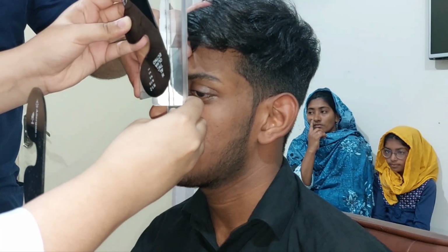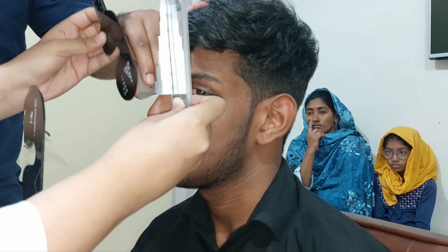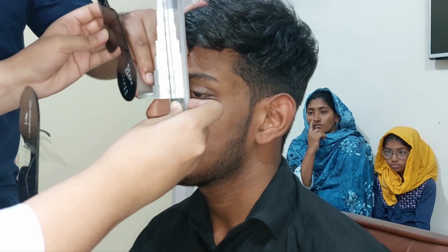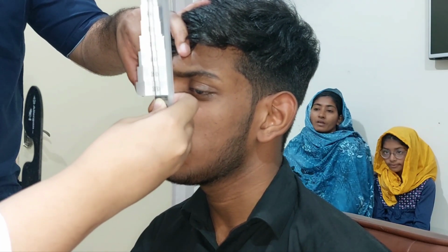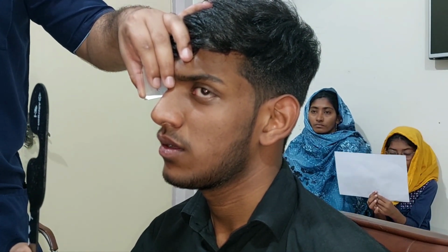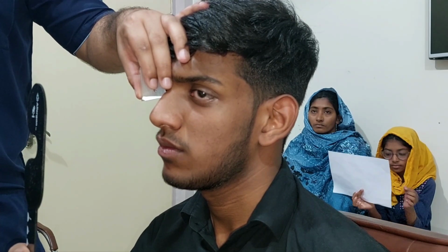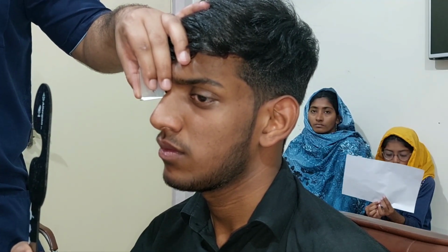To confirm it, you can also proceed to the angle of reversal. Increase the power of the prism and see when the direction of the movement reverses. So the amount of movement decreases, but as this patient has poor vision, we cannot clearly state as he does not take up fixation. Okay, we will see the other patient.